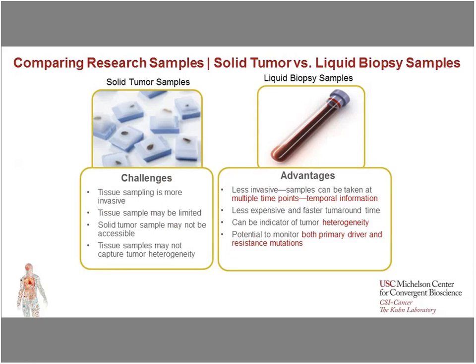Then the liquid biopsy's nature of global representation of current disease status can be an indicator of heterogeneity, and the potential to monitor both primary driver and resistant mutations can be achieved on both single-cell level and on analytes in plasma.